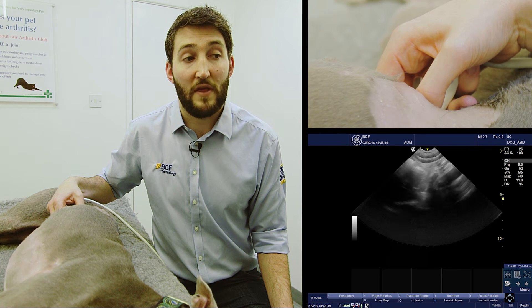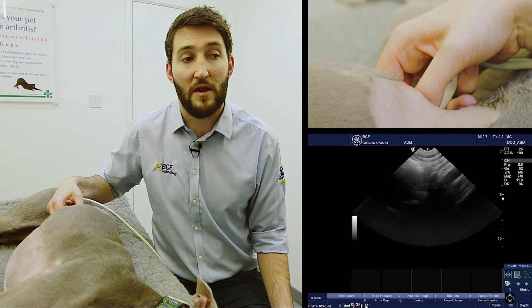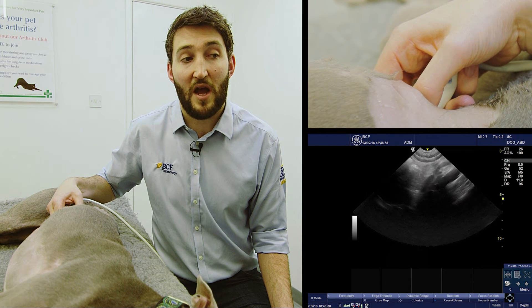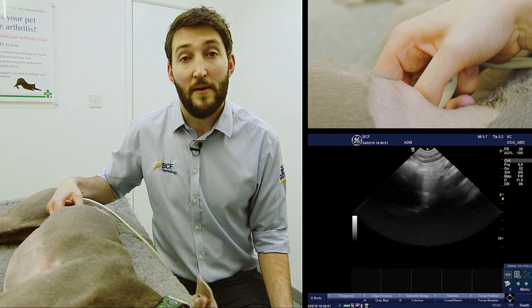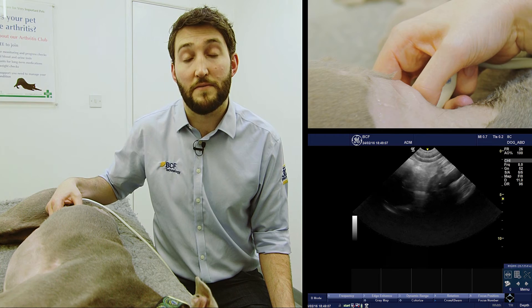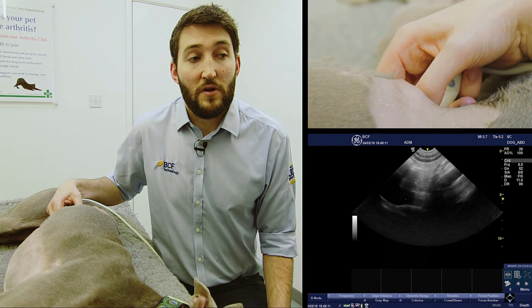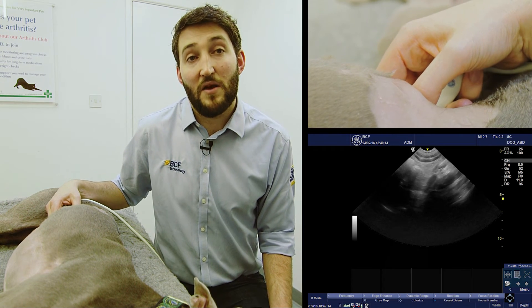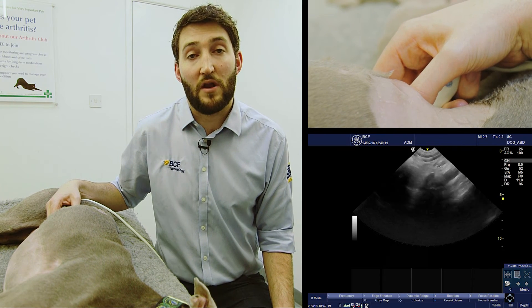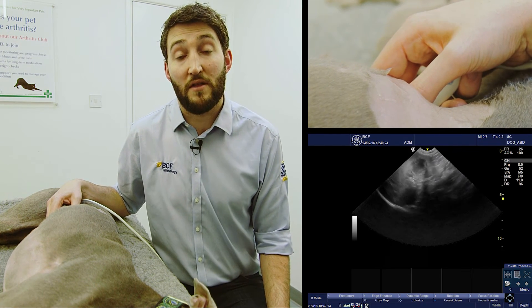Below and to the right is the aorta, so it sits in a line between the two. Off to the left of the image is the right kidney, although it's just out of the plane of the image here. You can see how intestinal gas can get in the way of visualizing the right adrenal gland. Similarly, if you've got an obese dog it can make visualization quite hard. It's more difficult to find the right adrenal gland — it's the less commonly seen of the two glands.